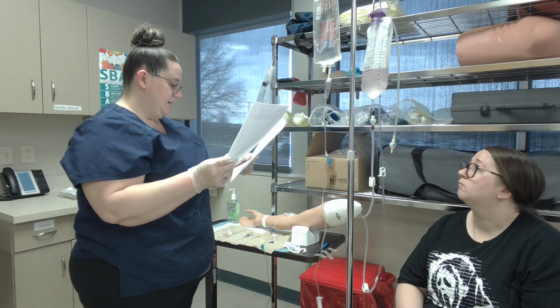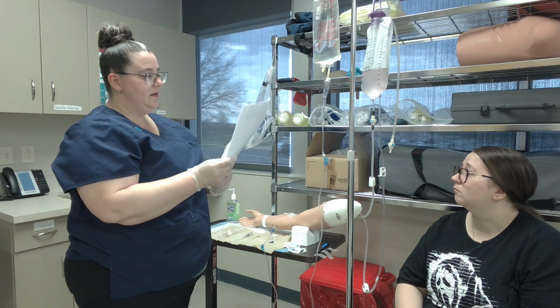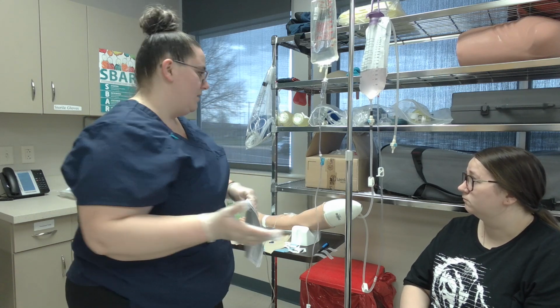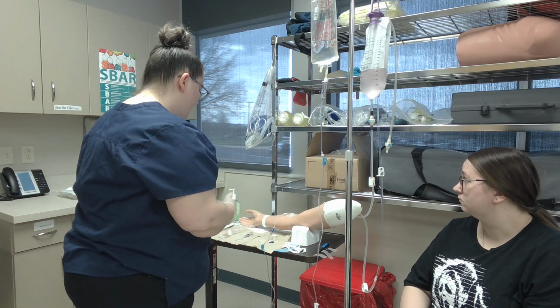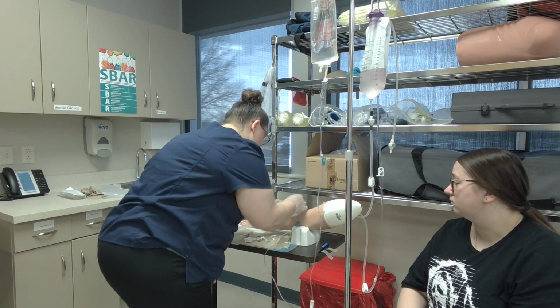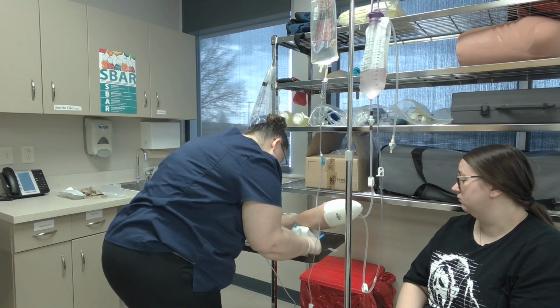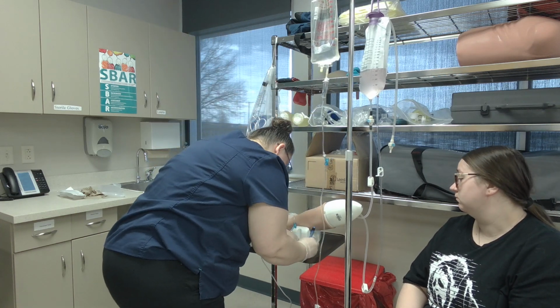And my drip rate is going to be, I'm having 100 ml per hour, 25 drops per minute. So I would have 12 to 13 drops for 30 seconds. And I did do this in class, so you stated that that was okay. So I would let everything run through. I'm going to clean up all my supplies. And I'm going to tape my tubing to my patient so that doesn't get tangled up. Then I have the date, time, and initials on my bag and my tubing.